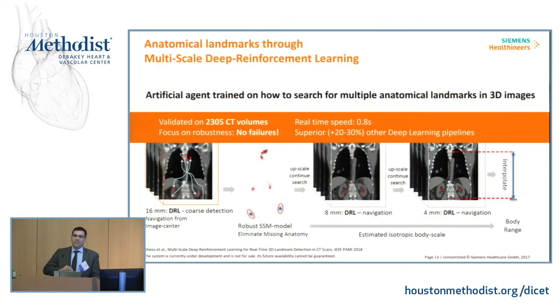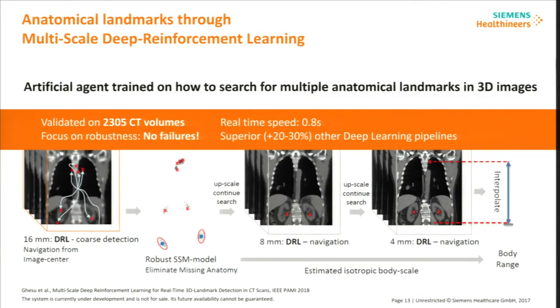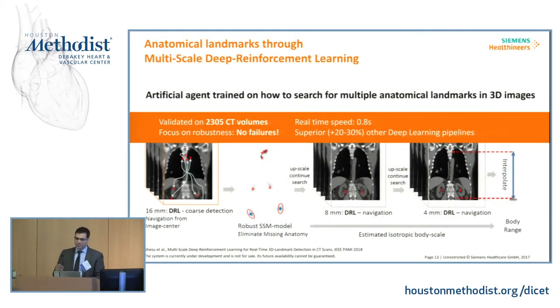Let's go a little bit more in the techniques, right? So all this might sound magic, so how does that work exactly? So in a traditional machine learning approach, if you want to know where an anatomical landmark is in the image, let's take the apex of the heart. What you usually do from a computer scientist point of view, right, is that you go pixel by pixel, right? And then you associate to each of these pixels a probability if that pixel is the apex. And you learn this probability using machine learning, so basically by providing these annotations and these images. Now, it's kind of computer intensive, right? Because you have to scan all the pixels and then assign this probability, and then the winner is the point that you are looking for.